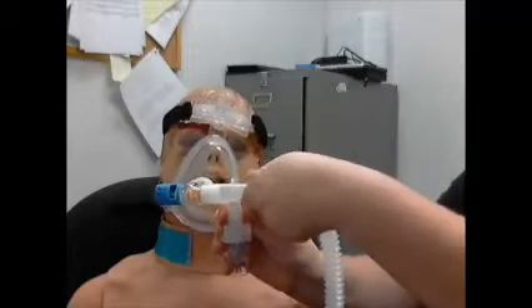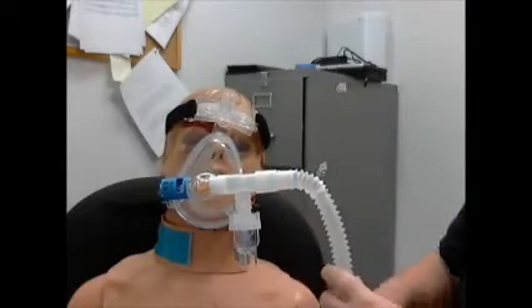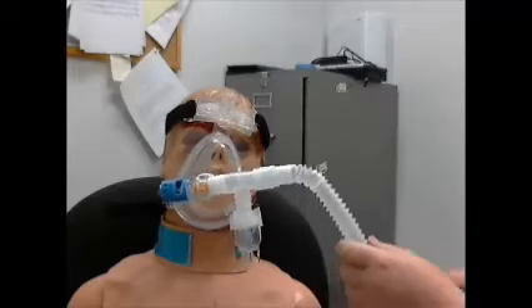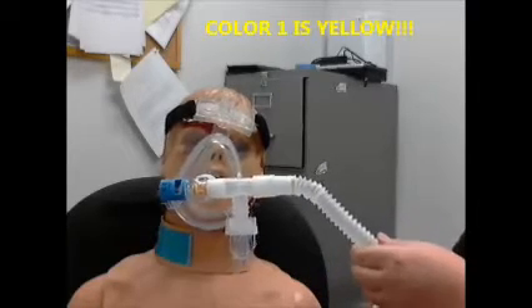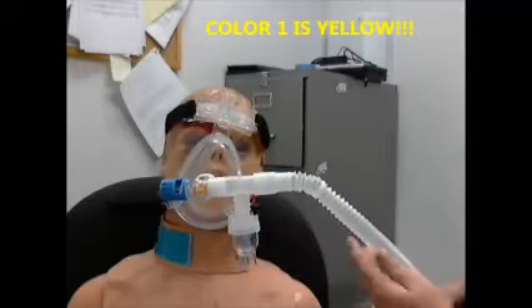Hook it in there. Turn your oxygen onto your nebulizer and make sure you're getting good mist on the patient's side of the CPAP tube. This has to be kept mostly straight with this bar right here parallel to the floor to keep the medication going.